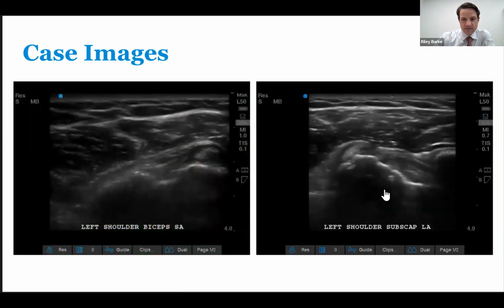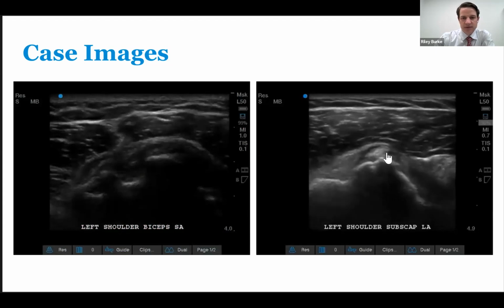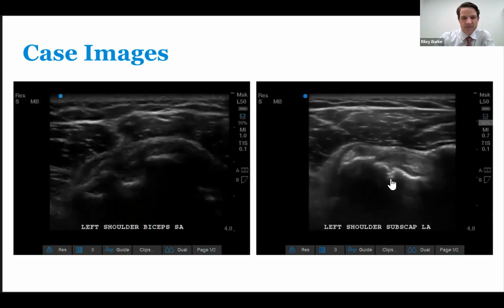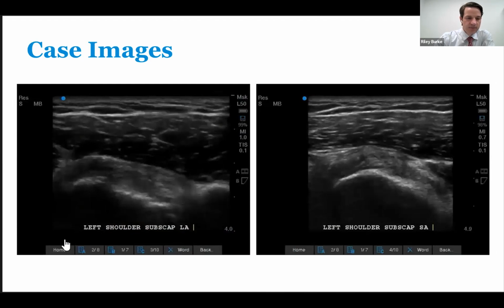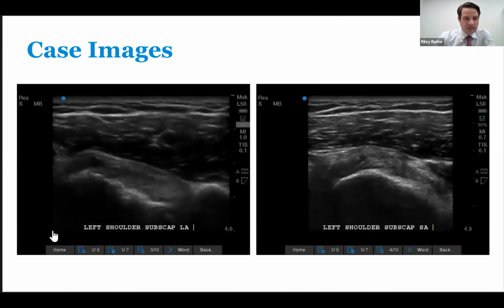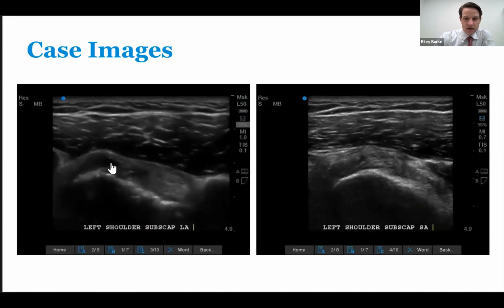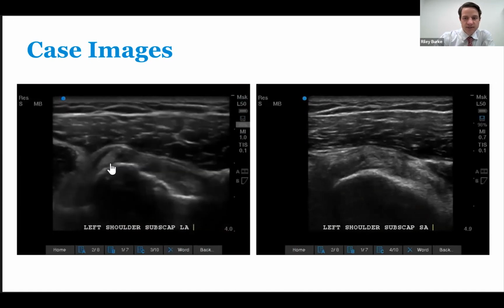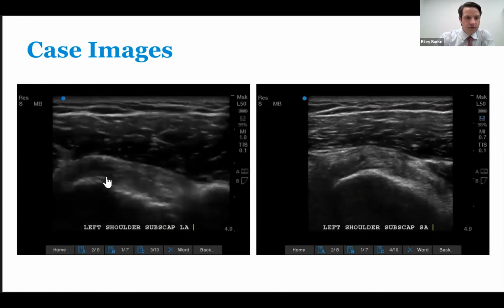As we first scan through the subscapularis, we notice that the bicep tendon again appears kind of embedded within the subscapularis. And maybe there's some mild cortical irregularity, but otherwise, there's nothing really we can discern much more. As we continue to scan the subscapularis tendon in long and short axis, we appreciate this large hypoechoic interruption of the distal and cephalad fibers with few intact bursal-sided and articular-sided fibers.